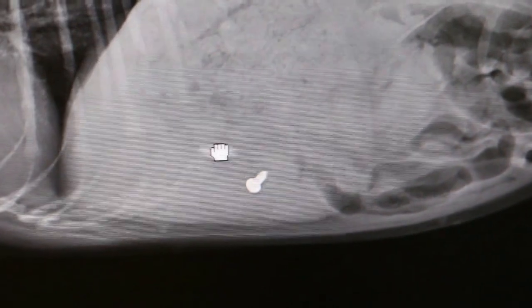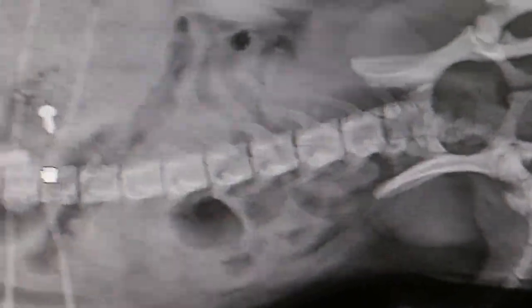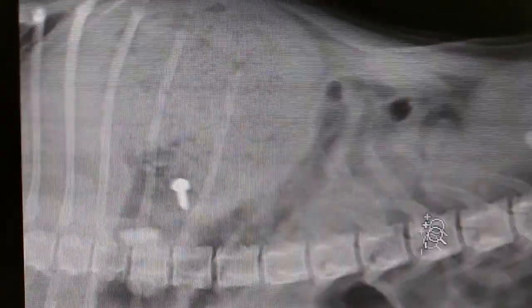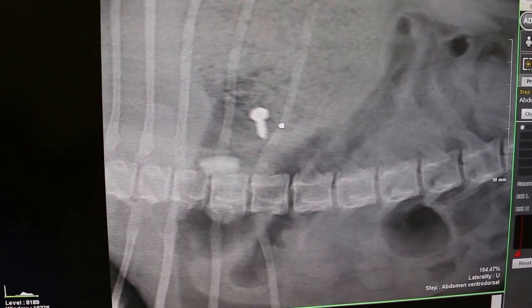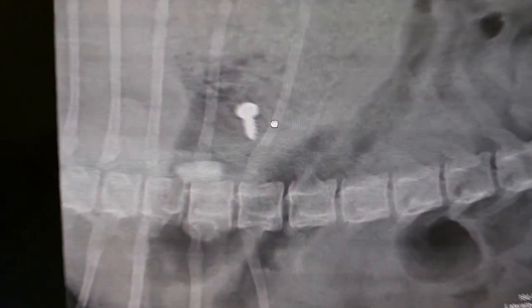Can it be enlarged? Much bigger. Is it in the stomach? Let's see the other view, the ventral-dorsal view. Is it outside the stomach? The screw is definitely in the stomach. How about the other piece? Also in the stomach. The other piece must be removed — otherwise diarrhea comes again. This is bad diarrhea.